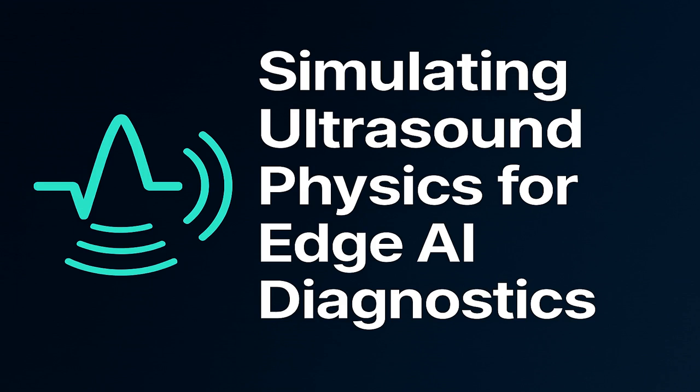Fourier transform: X(f) = ∫ x(t) e^(-j2πft) dt. It's the core mathematical tool here. It is. It fundamentally converts a complex time domain signal into its component frequencies. And that transition is absolutely vital for simulation. Why? What's the benefit? Because many physical effects that are represented by these really complex time domain convolutions, things like geometric travel time or the filtering effect of attenuation, are mathematically transformed into simple multiplications or phase shifts in the frequency domain. Okay, can you elaborate on that a bit?